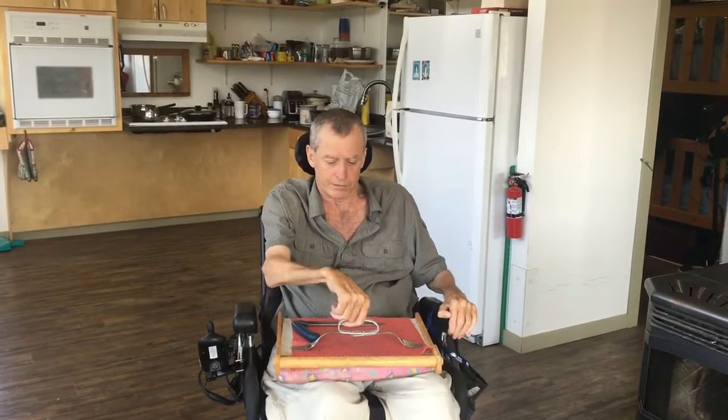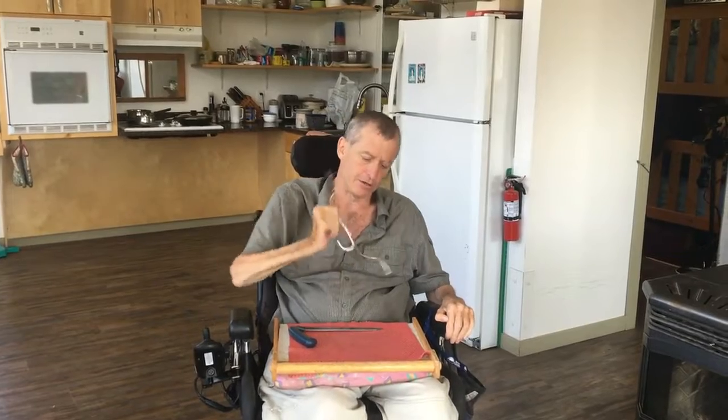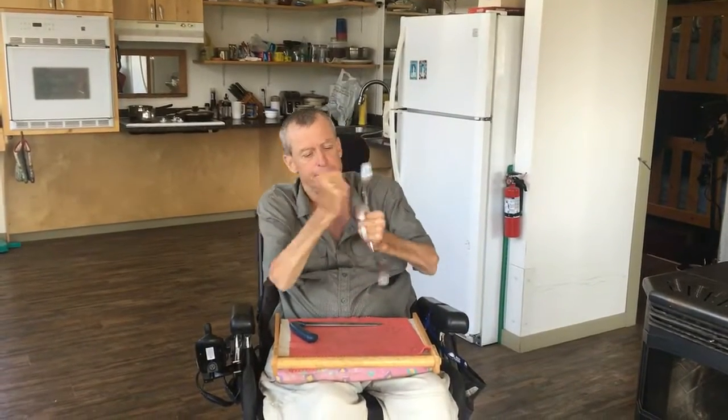And then I can use this fork here. It's just two forks. They're riveted onto this piece of aluminum bar that's shaped to my hand, end to end. And I can just go like this, slide it onto my hands, and then it's stuck on there really well.